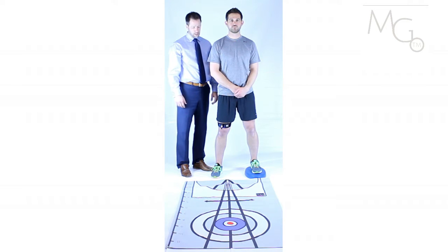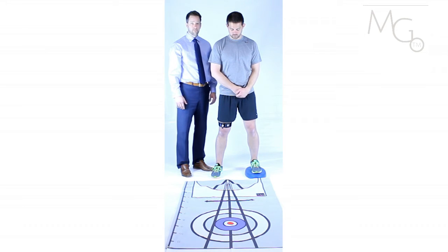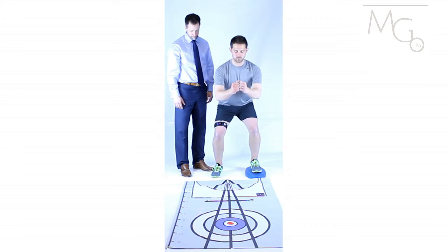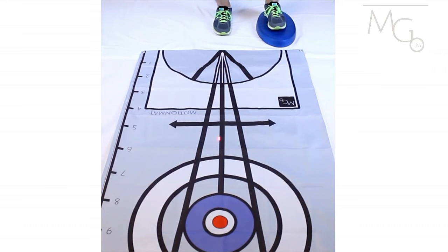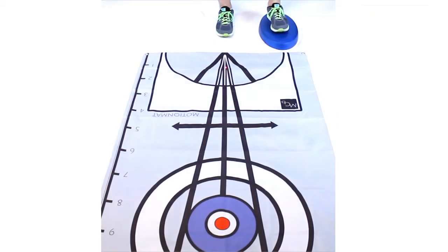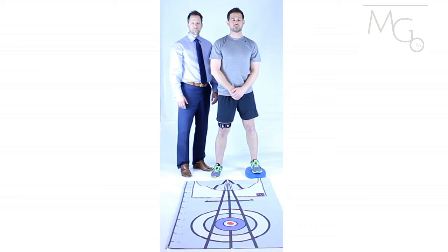As a different progression, the patient can put a soft surface under their non-involved side, apply the Motion Guidance device to the involved side, turn on the laser, and perform more squatting activities. This will give the patient an option of using partial weight bearing to progress to full weight bearing on the involved side.